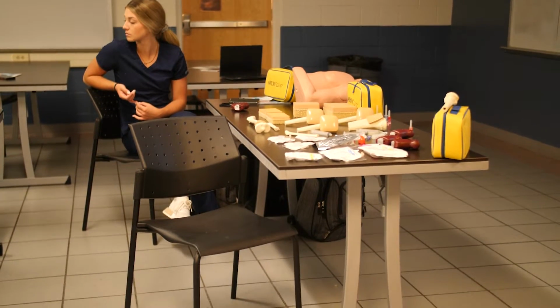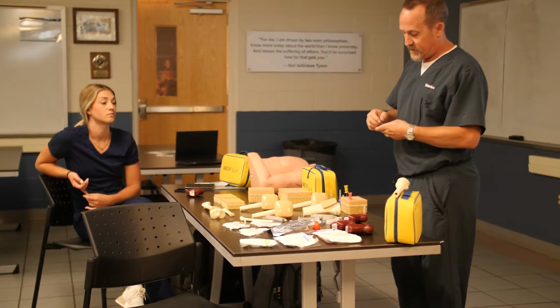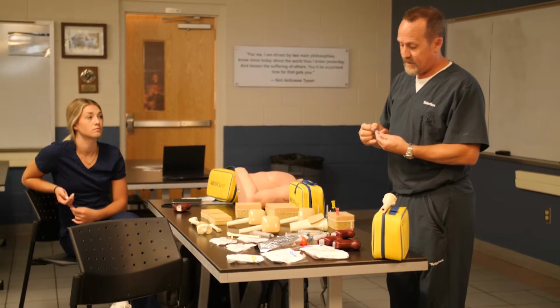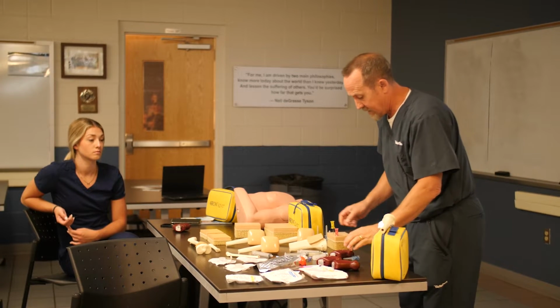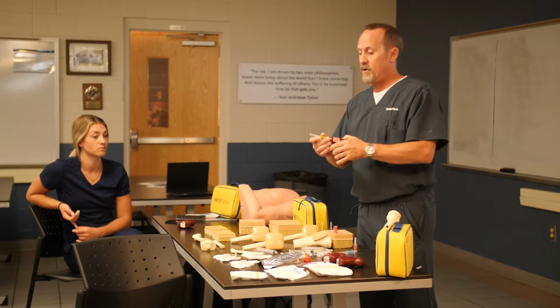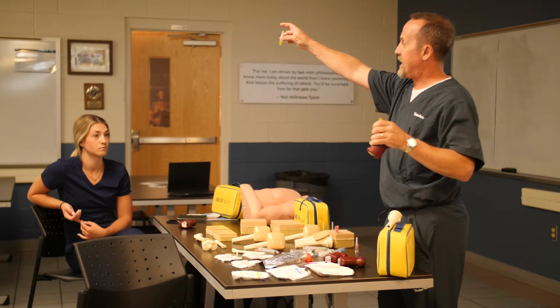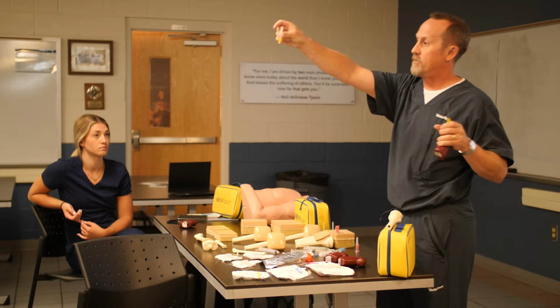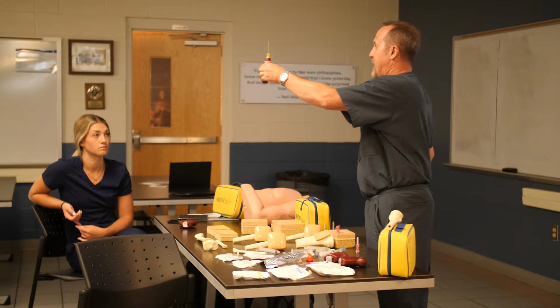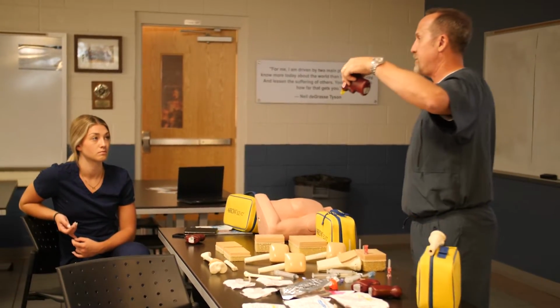Okay, perfect. The reason it's very important to recognize the black line showing that you have a catheter on there is I see this happen frequently: somebody is in a code case, they're in a hurry, we're getting this loaded on the driver, and they pass the driver off and they've taken the needle cap off, but you notice, I took the catheter with me. I didn't slide the needle cap off, I actually twisted it off. So if you are ever handed a driver and you see a needle set on there and you do not see black lines, do not engage the patient.